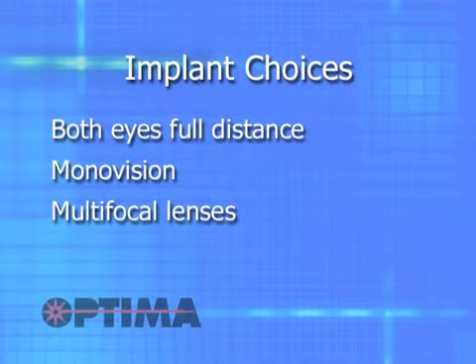In that case, we have another option, which is to place what's called a multifocal lens inside the eye. Now, with respect to the multifocal lenses, we have a couple choices there too. Now, all the multifocal lenses are very good for the distance, but some are better for intermediate as well as distance, and some are better for near as well as distance. And again, depending on your lifestyle and your individual needs, we'll tailor the implant according to your needs. And again, a LASIK fine-tuning following the surgery may be necessary to achieve our goals.